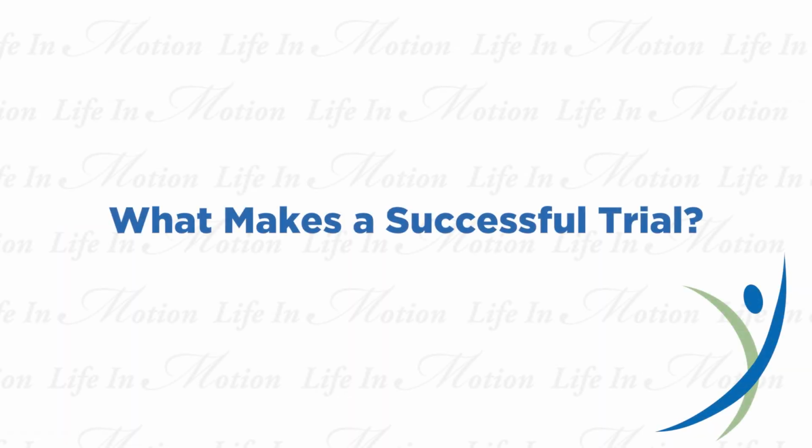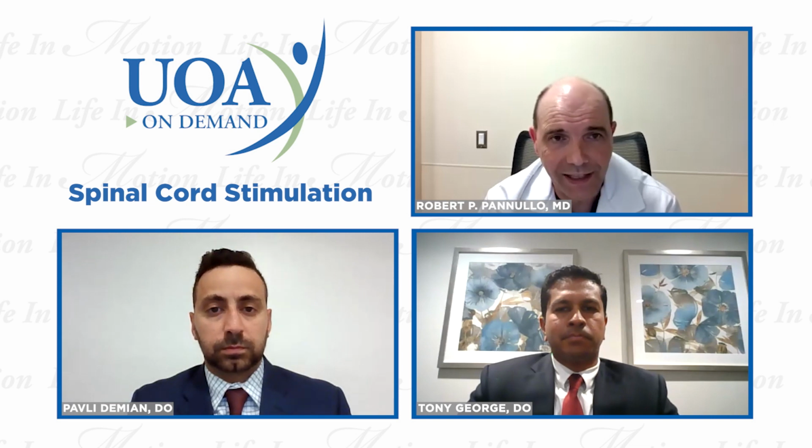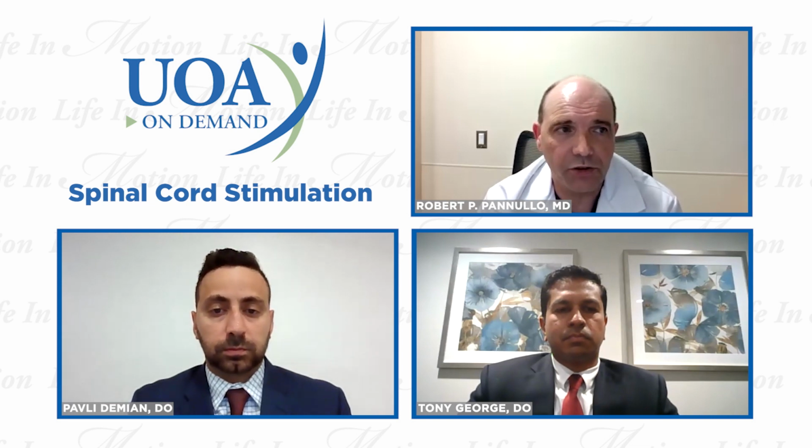Dr. Pannullo, I'll follow up with you. What makes a successful trial for a patient? Typically, we're looking for a significant reduction in pain, so clearly better than 50%. And we're looking for functional improvement because over that trial week, I want my patients to be walking, to be doing things. Not anything to excess, but at least to try to engage in some normal activities, and then be able to assess how that has affected their life during that week, so as to then determine, is this something that they would want to have in them?